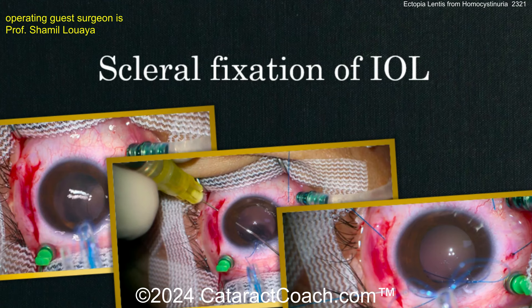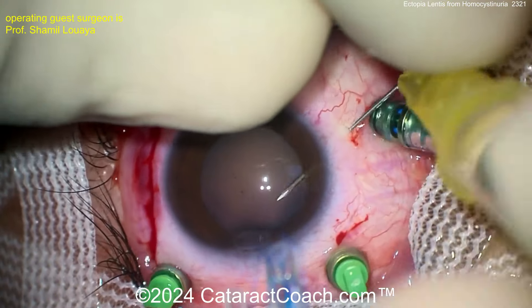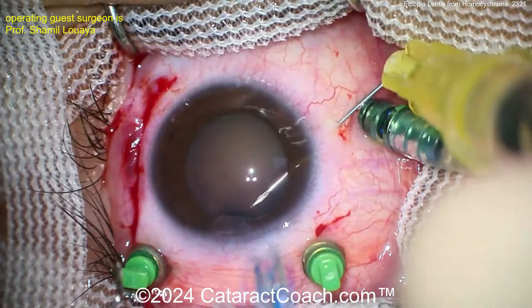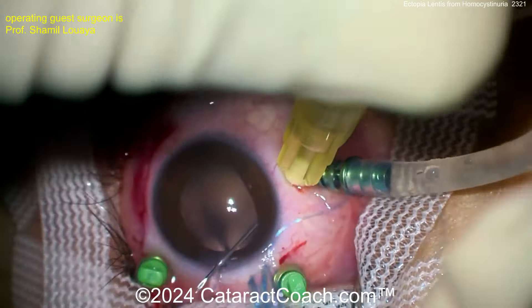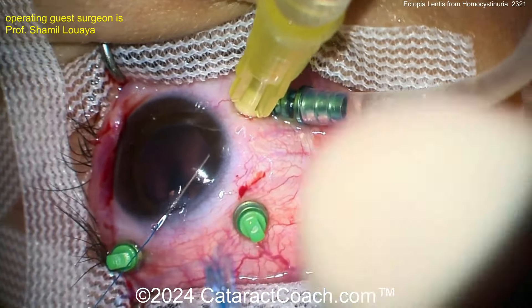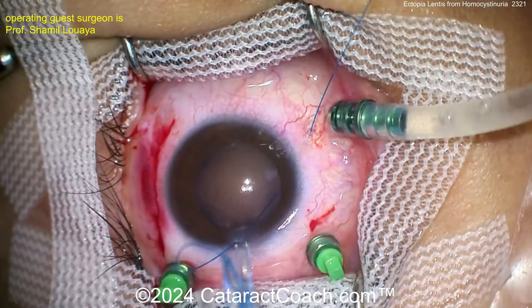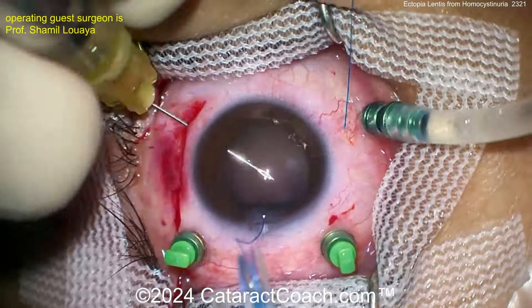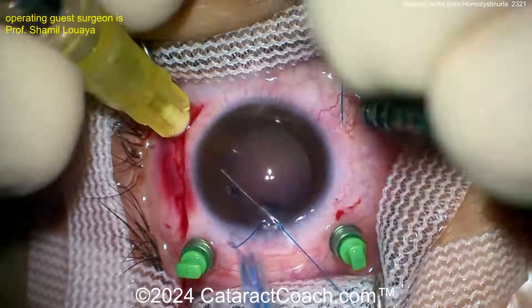Now for scleral fixation: marking off with a 30-gauge needle — maybe 27-gauge, hard to tell — and bringing it outside the incision, then threading one of the prolene sutures through. Thread that prolene suture through, pull it outside through the scleral wall — there it is coming out nice and easy. Repeat that four times, one, two, three, and four, to get all the sutures out.